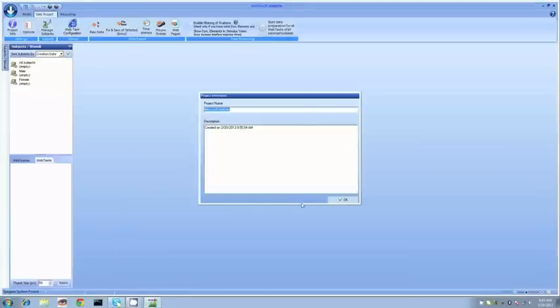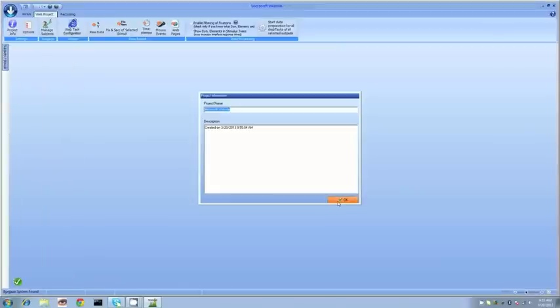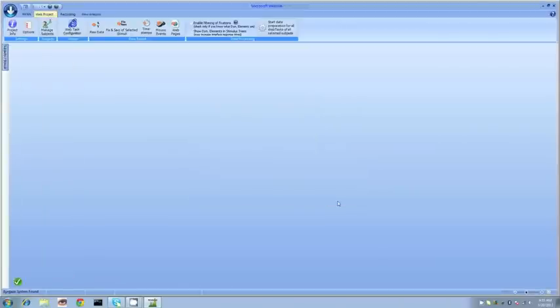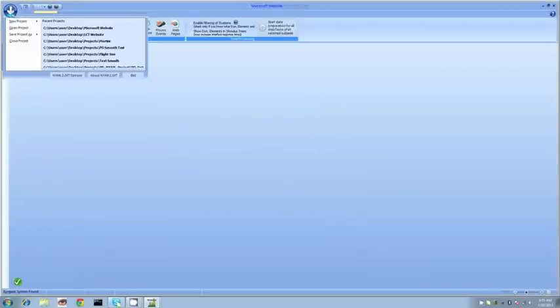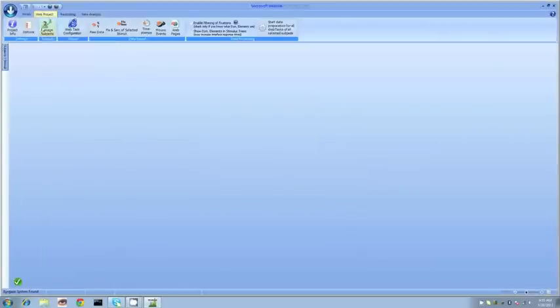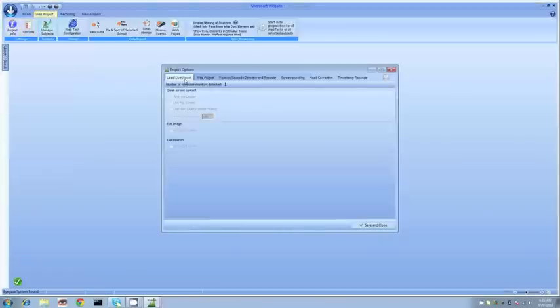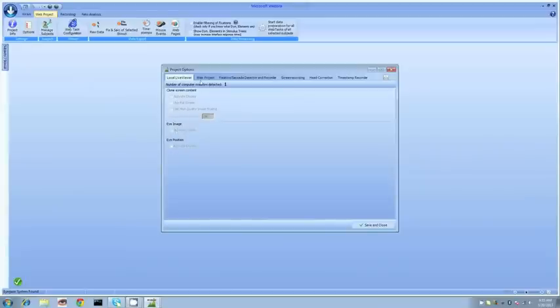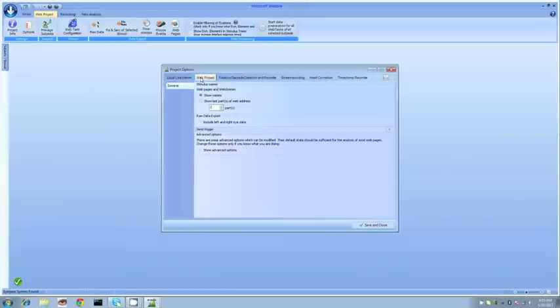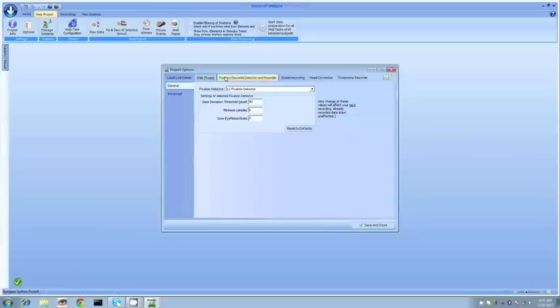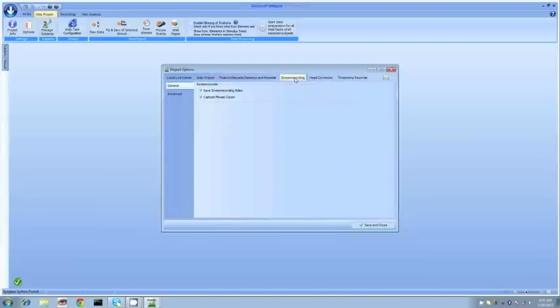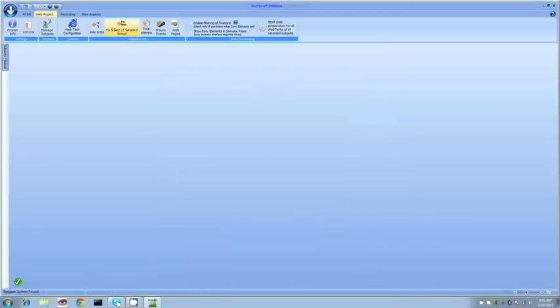We have this box here where we can put in any information describing the experiment. First we can go into our project settings to modify a few different things. The first here is the second monitor feature - we can actually add up to two other monitors to view the experiment live from a different monitor. We can change other parameters here, including how we define fixation, saccadic movement, and modify any kind of data analysis beforehand.